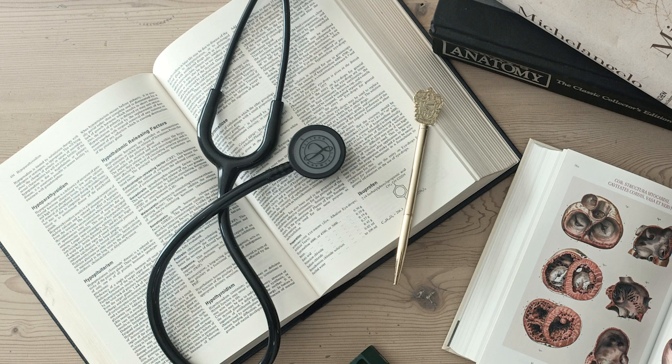And you mentioned a quick bedside tool for differentiating atrial from ventricular tachyarrhythmias based on the QRS complex width. This sounds like a critical point for rapid assessment, especially in an emergency. Yes, this is a vital clinical discriminator that can guide immediate management, although it's not foolproof. If you observe a narrow QRS complex tachycardia, meaning the QRS is less than 0.12 seconds wide, it is usually supraventricular, SVT, in origin.